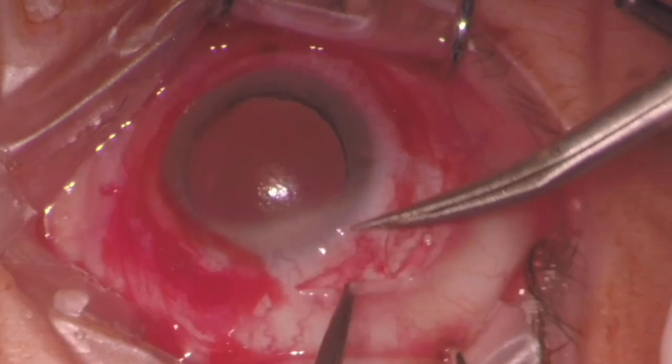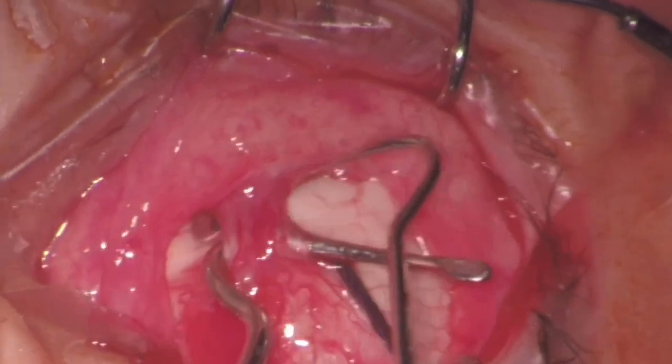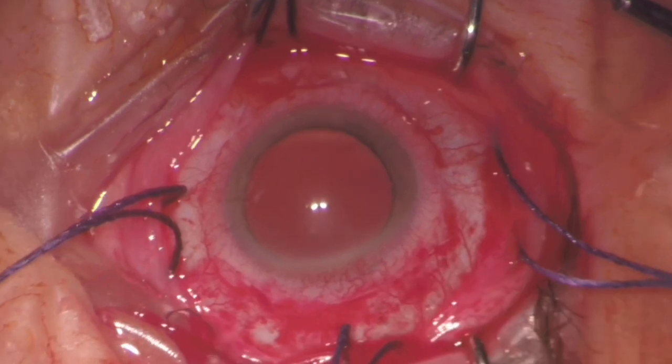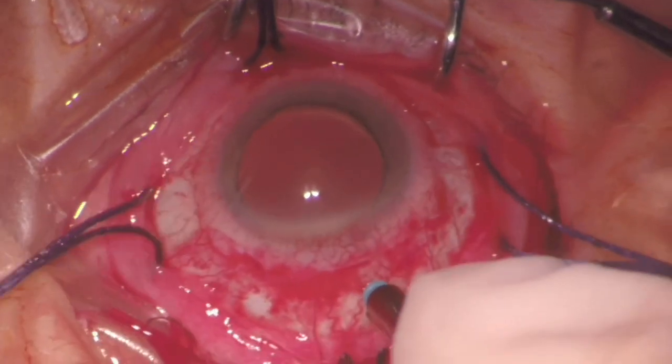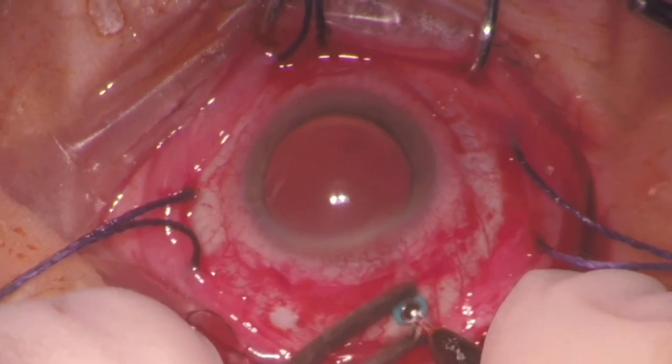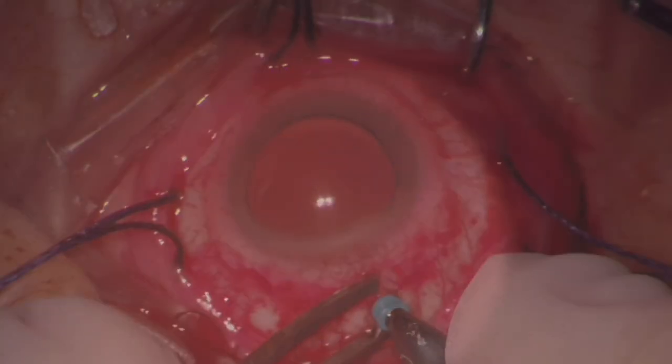The surgery begins with a 360-degree peritomy, with isolation of the rectus muscles and placement of a chandelier light. Since the breaks were located in the inferior hemisphere, it was preferred to place the chandelier superiorly. The use of a chandelier light and a non-contact viewing system can greatly help in the evaluation of the retinal periphery and makes the surgical steps of cryopexy faster and more effective when compared with binocular indirect ophthalmoscope.